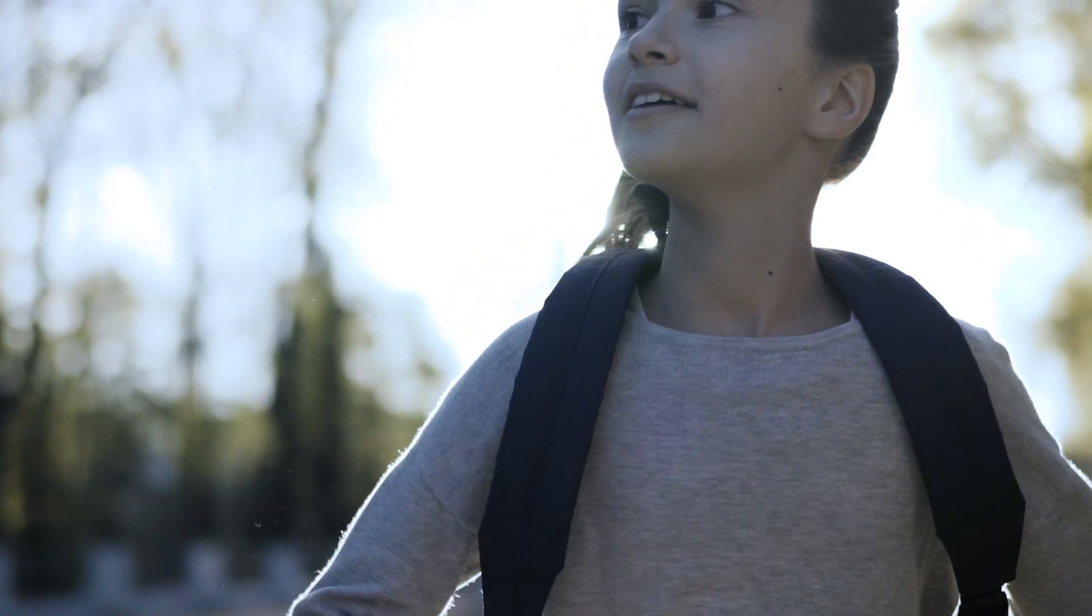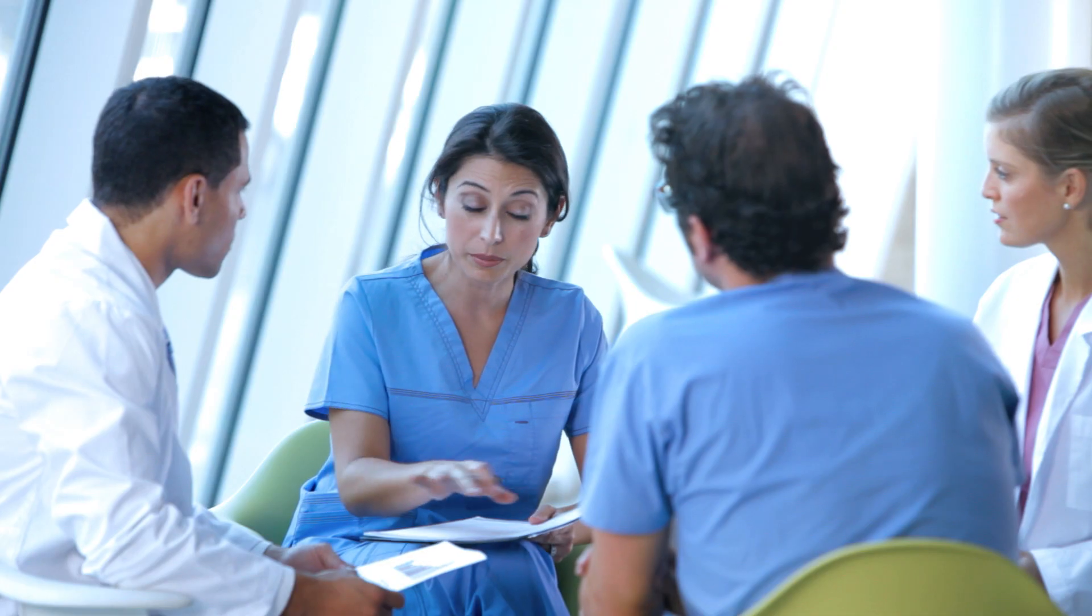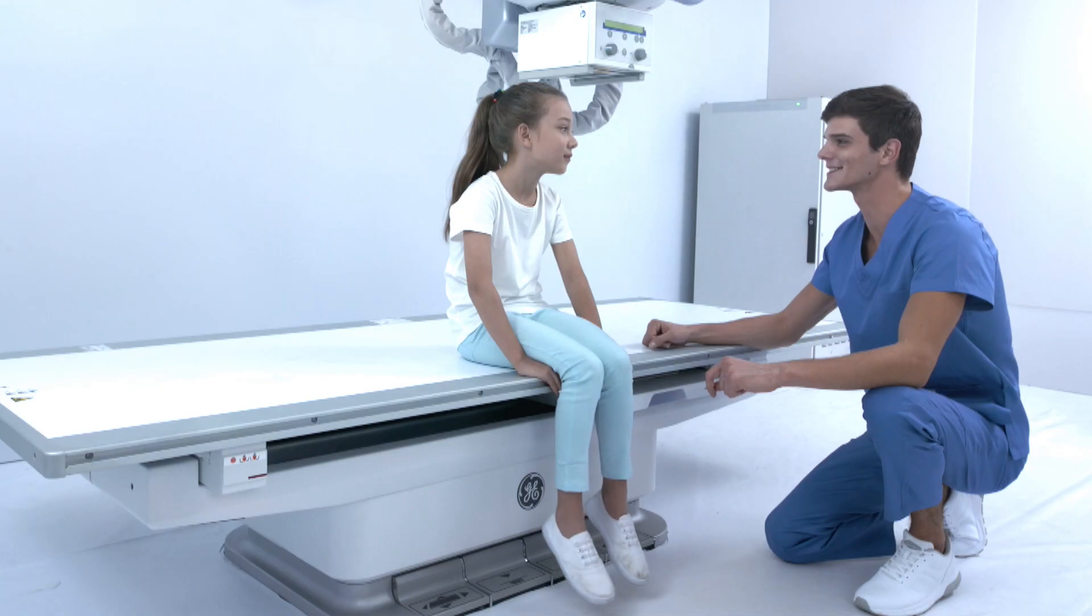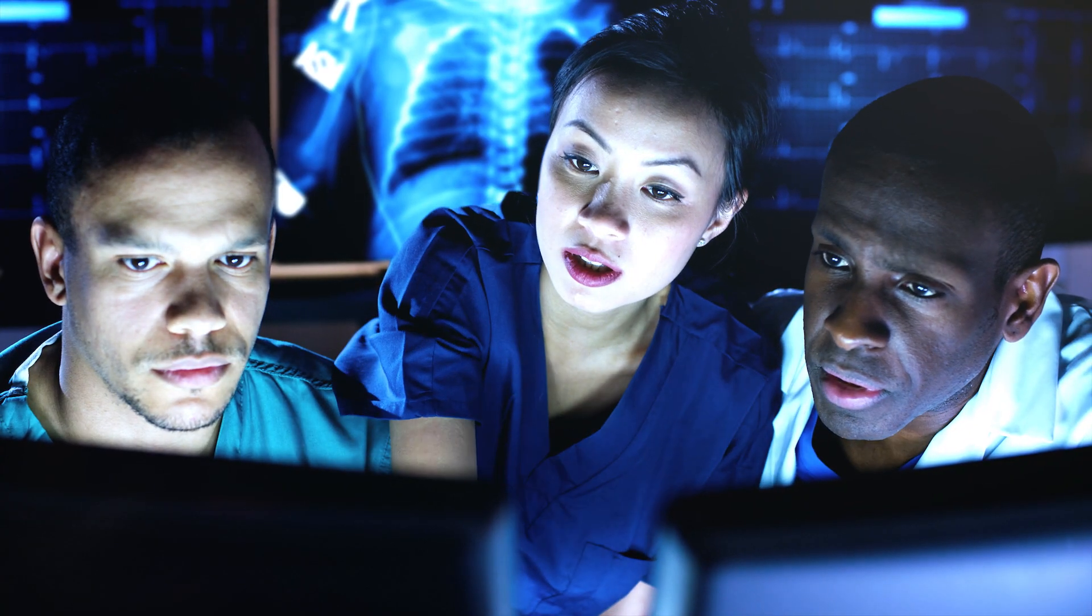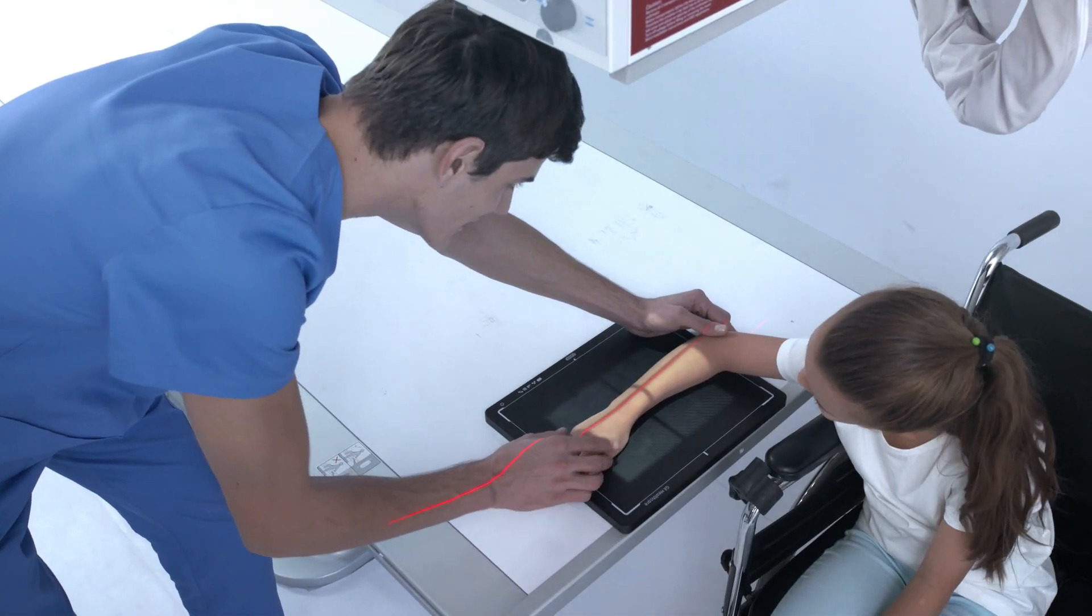Because the first x-ray image helps you start off the patient care journey, at GE Healthcare, we believe x-rays should deliver the clinical confidence you need from that very first image, so that you can focus on what matters most, your patient.